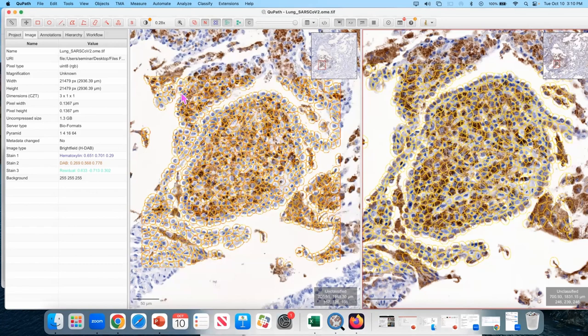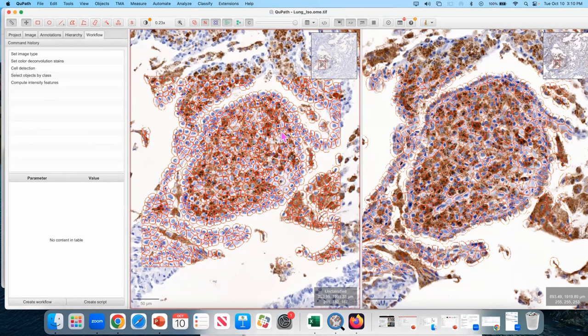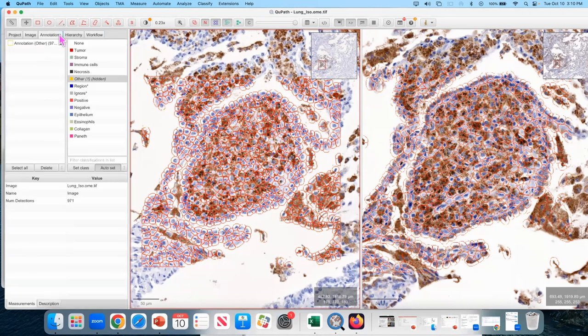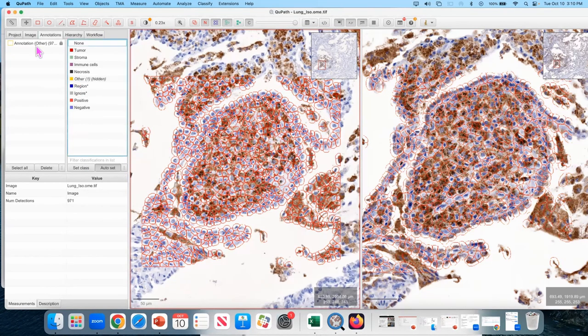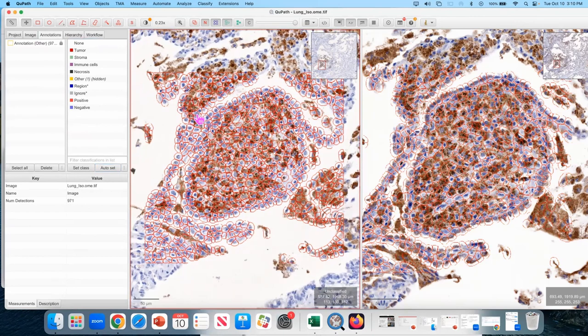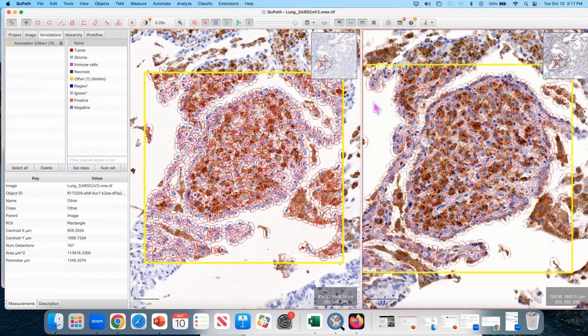So now we hopefully have the same workflow on both of those images. And normally I would add some smoother features and massage this a little bit more. But all I would like to do now is I'm gonna reset the default classes. I made a mistake. My auto set was on. So all of my annotations got automatically annotated. So I'm just gonna go and click none and set class. And I'm gonna be very careful to do it on this one.